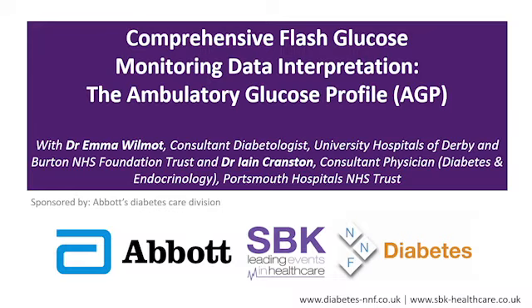And it's a conversation I'm increasingly having, because I think people with diabetes often imagine that they might be at 70% time in range, but they imagine that everybody else is at 80. Just giving them the perspective that actually they are achieving the goals and doing really well.